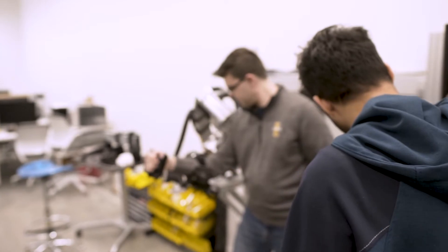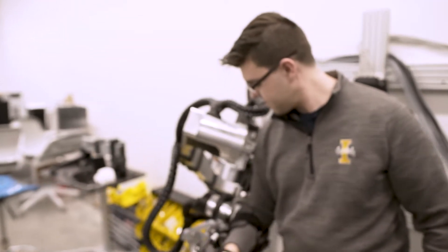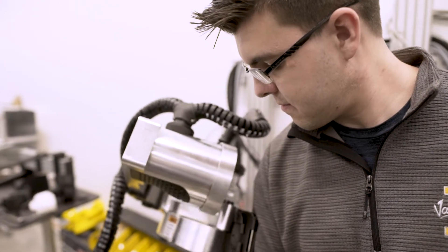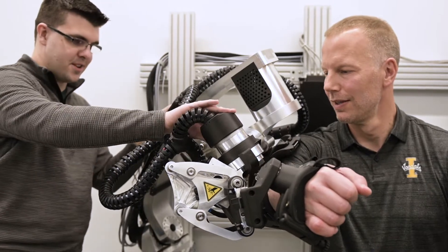In the period right after a stroke, you're kind of in a race to get as much therapy time as possible because your brain is the most plastic in that time so you can recover the most quickly in that short period. Robots open up that possibility.